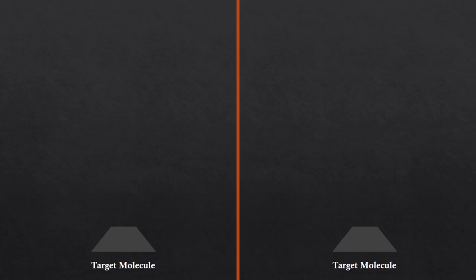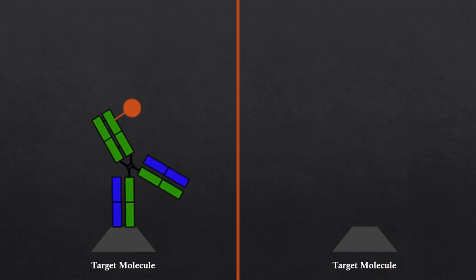Researchers initially started using the direct method. However, there were multiple issues with this form of staining. The direct method's specificity greatly depended on the serum that was being used. However, it lacked sensitivity. With just one antibody attached to the target molecule, there was only one label that could be attached per protein. The label molecule that was most commonly conjugated with antibodies was the horseradish peroxidase.